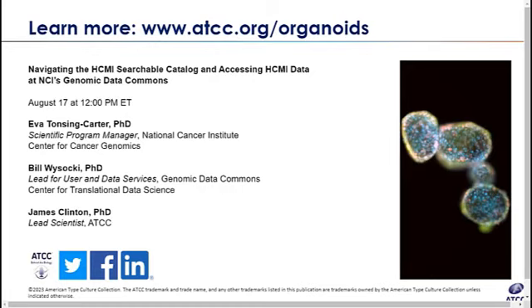Sure, I can try to address that. So N-acetylcysteine can be difficult to get back into solution. Again, in our kit instructions, and I believe it even does that in some of the videos as well, we recommend warming it in a 37-degree water bath for a period of time. Also, vortexing it repeatedly can help it enter solution. It's not uncommon that sometimes it can be difficult, but it will go into solution with a little bit of that.